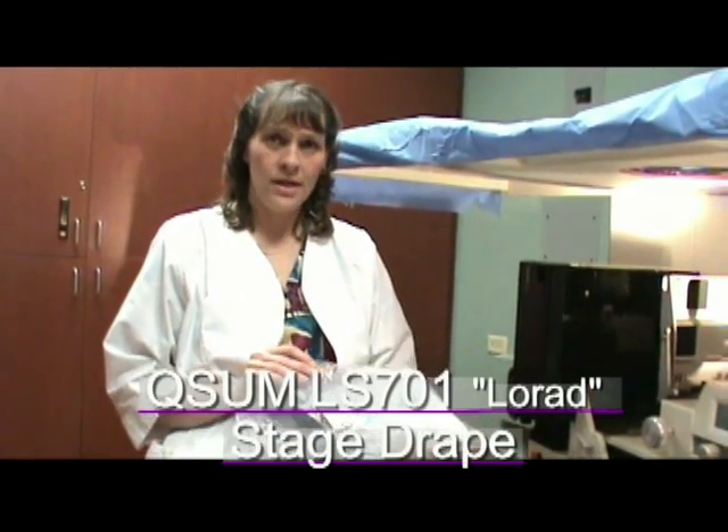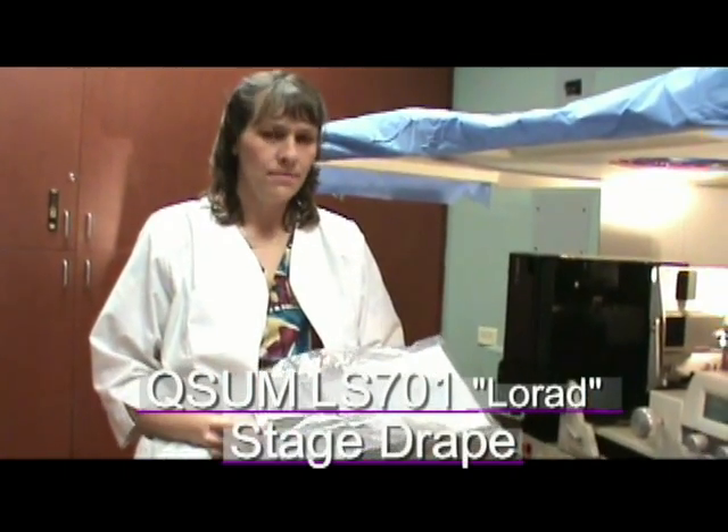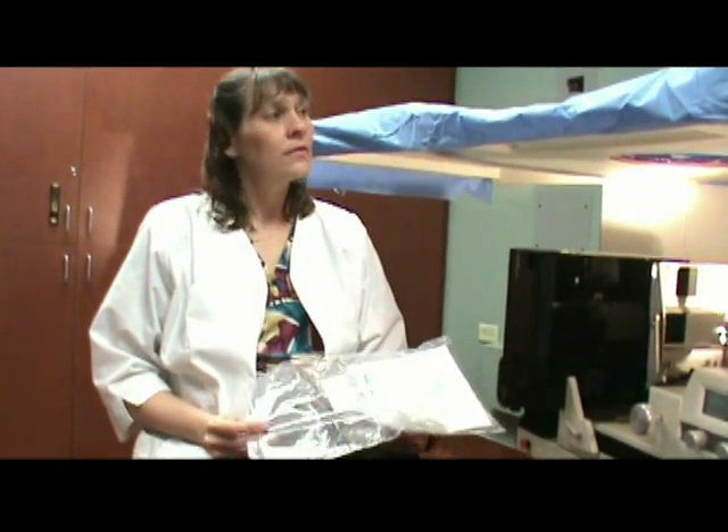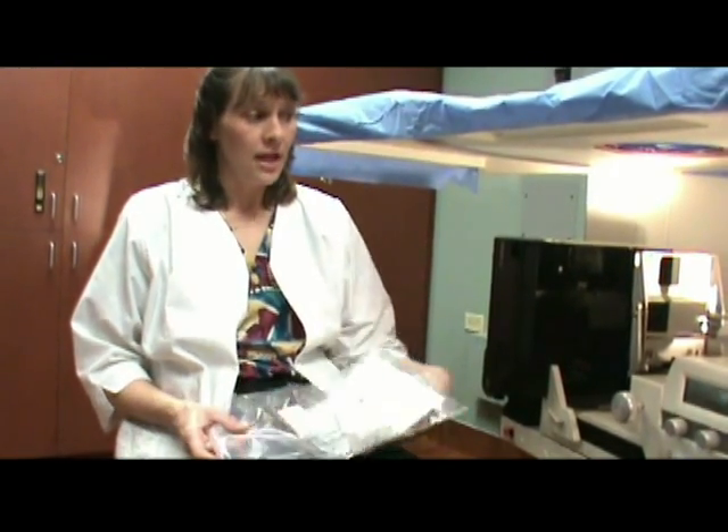This video will show the proper installation and advantages of the QSUM LS701 Lorad stage drape. The stage drape actually consists of three pieces: the control panel cover, the main drape, and the needle guide.